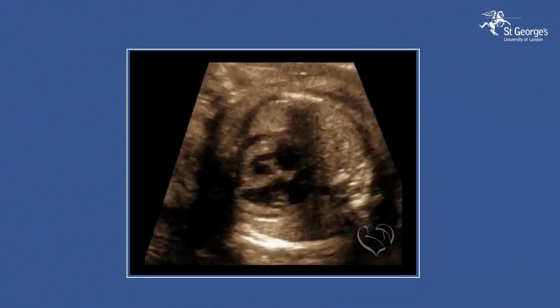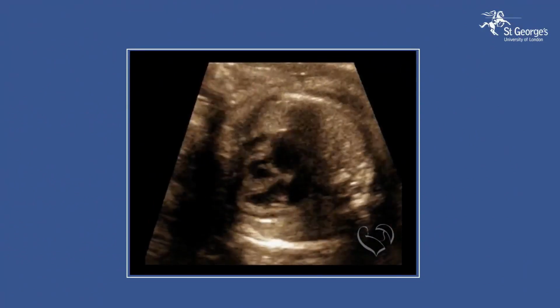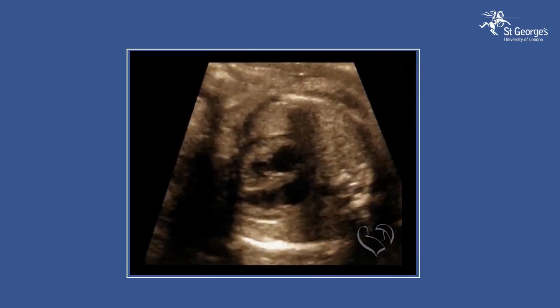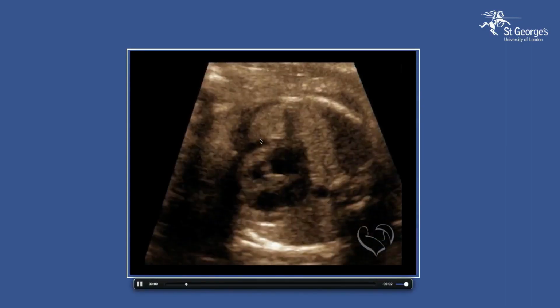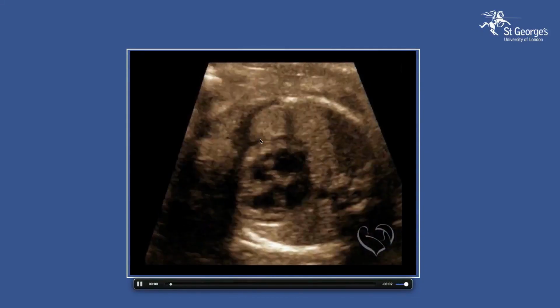So we are going to have to go fast now because it's tachycardia and also we're coming to the end, so we're going to speed up a bit. I think we'll finish on time. So tachycardia, there we are, clip. We're used to that. You can see there's a bit of pericardial effusion. So even if this baby goes into sinus rhythm, you would watch this very carefully. A bit of effusion, this is probably in tachycardia most of the time.